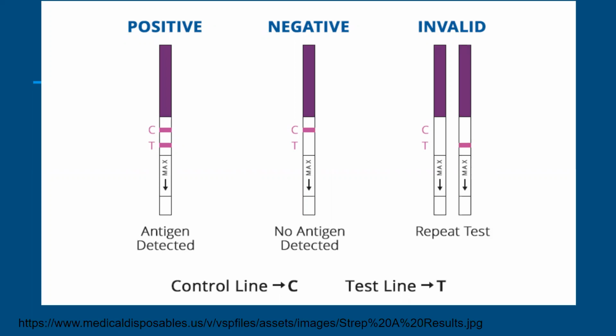If you do run a test with no control line, see in the third picture there, the control line is not there for either the positive or the negative testing result. So those would be invalid and would have to be repeated.